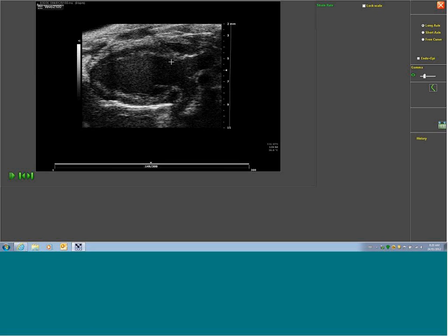So to begin the trace, I'm going to want to trace the endocardium, and I'm going to do this by left-clicking, placing points. So I'm placing points along the endocardium. I typically recommend placing about 12 to 13 points. To end, you're going to want to right-click. Now, for example, let's say I want to find out, am I happy with where I've placed my points in the trace? I want to go over to the Start Analysis button. It'll begin to calculate.